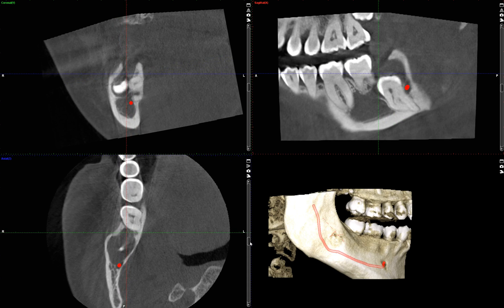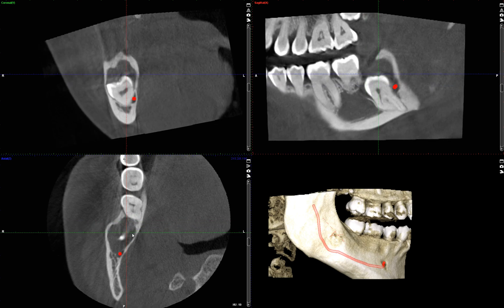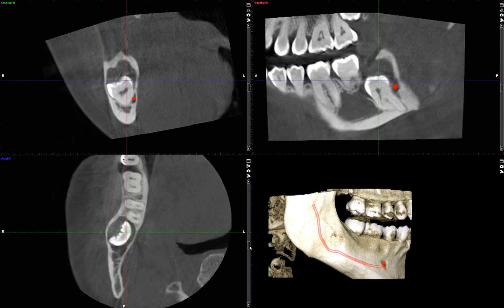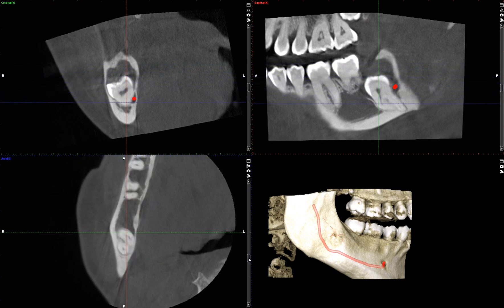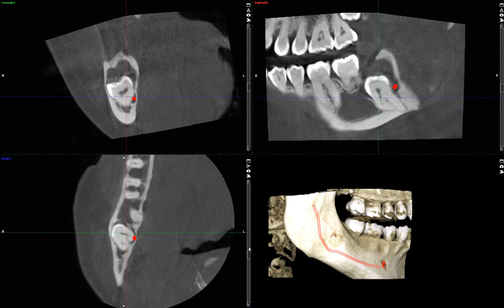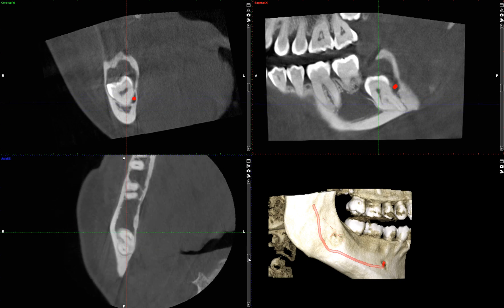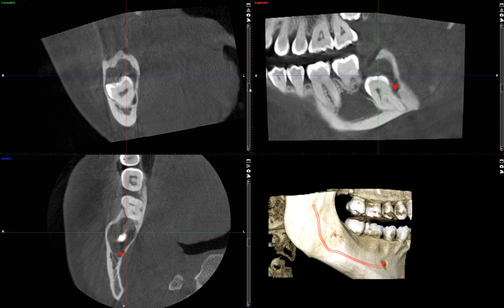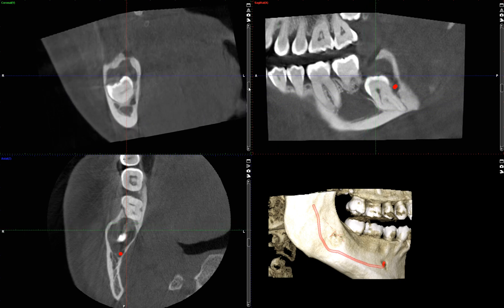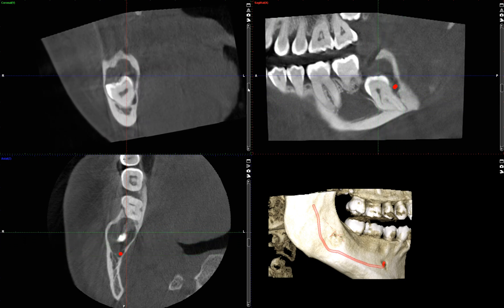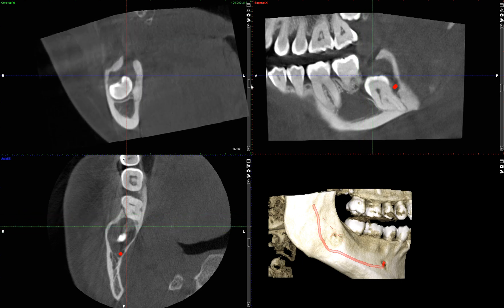Going through this on the axial plane, it does seem to occupy the full buccolingual thickness of the ridge. As I continue toward the apex, you can see that the mesial and distal roots tend to converge toward the apex. Let's now look at this in the coronal plane.